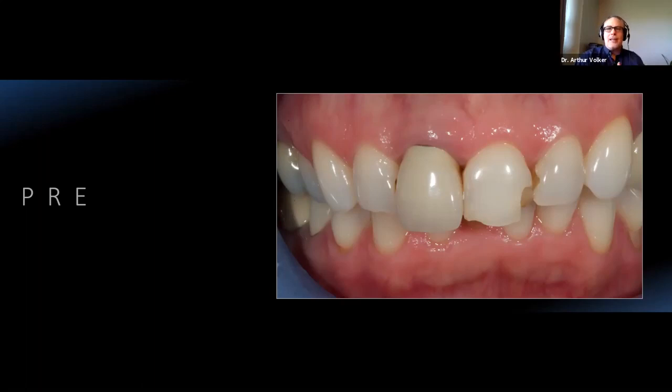So this patient came in, and I was her 5th consult or something like that. And she had concerns, and people wanted to do all sorts of things, and they want to crown. So she just came for an opinion. And I said, okay, let's take a look. And she had some issues. And as we can see, she looks like she has a bit of overbite. There was a lot of wear from using her crown on number 8, where it was a low fusing, likely a low fusing porcelain, which is very, very abrasive to the adjacent teeth.